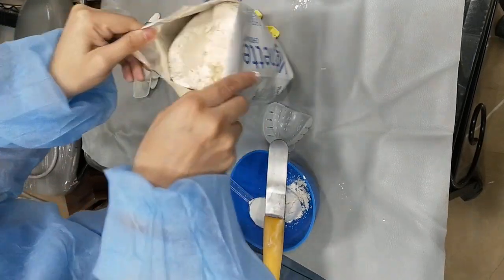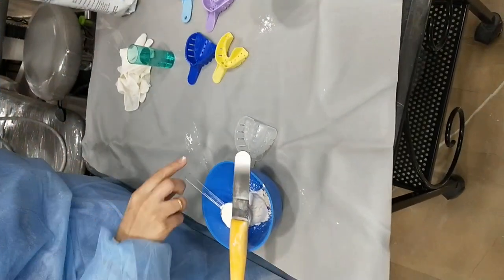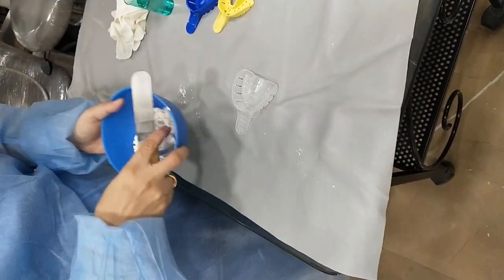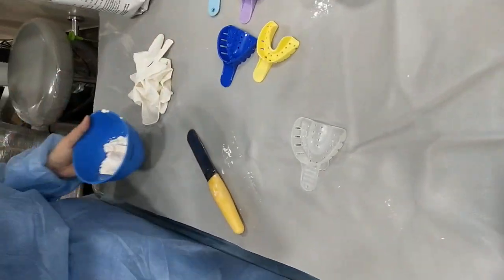So, as we spoke about the ratio earlier, we are going to take the water up to the second marking, that is, the lower second marking of the cylinder.